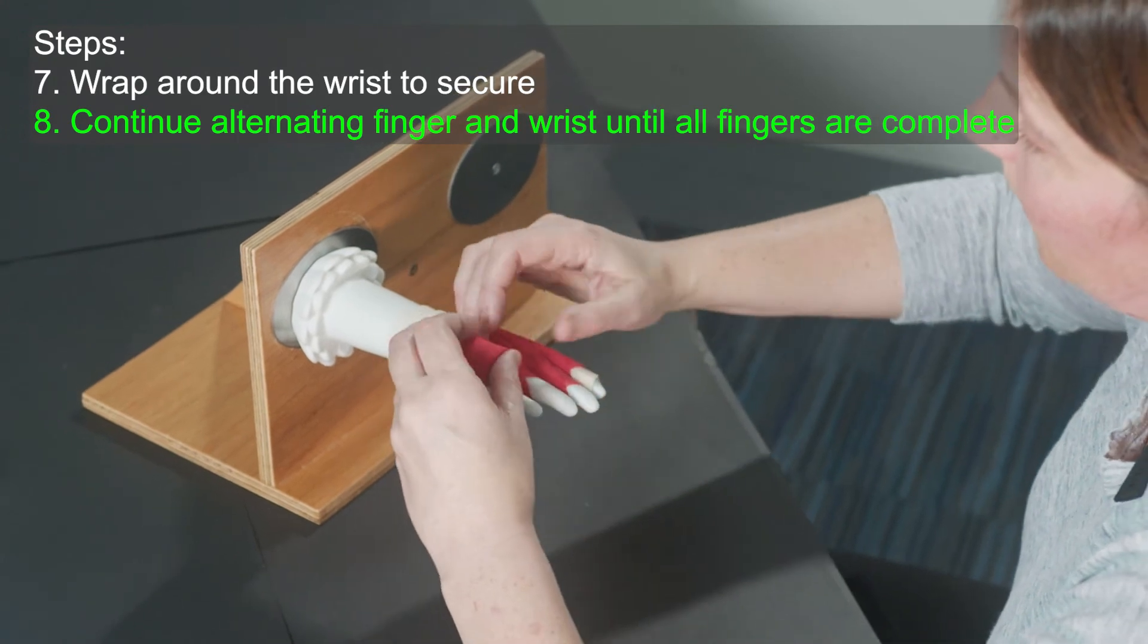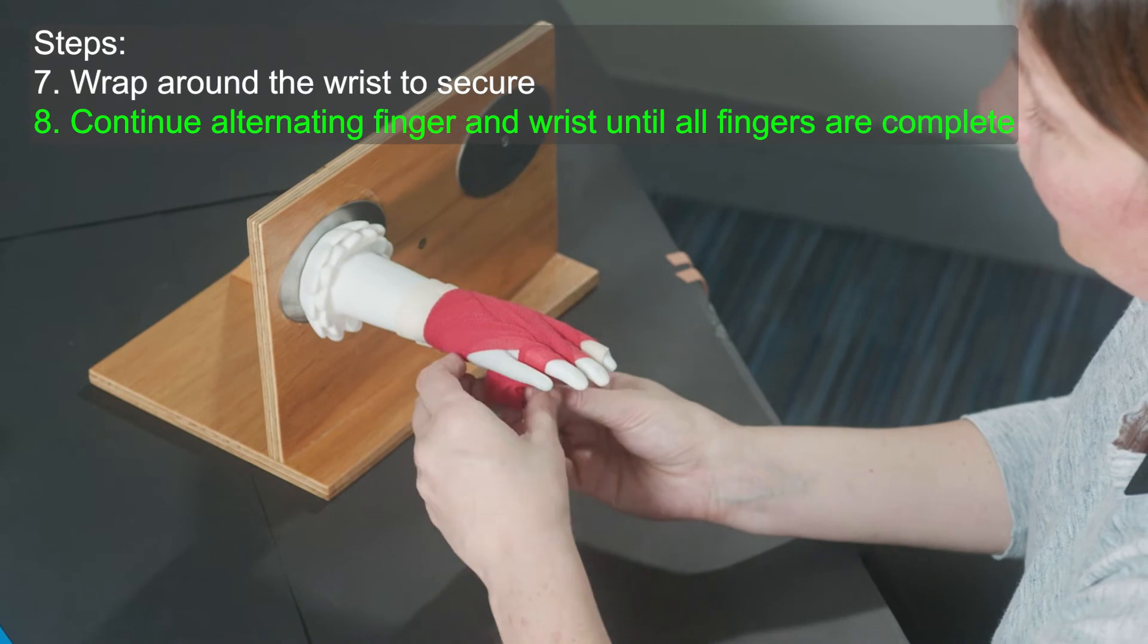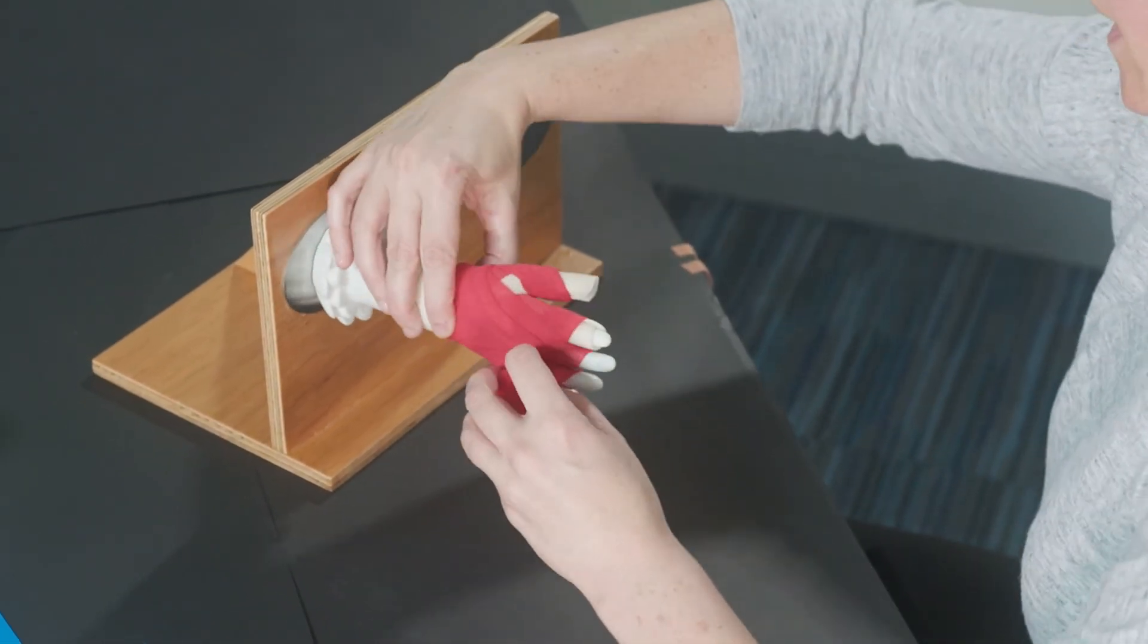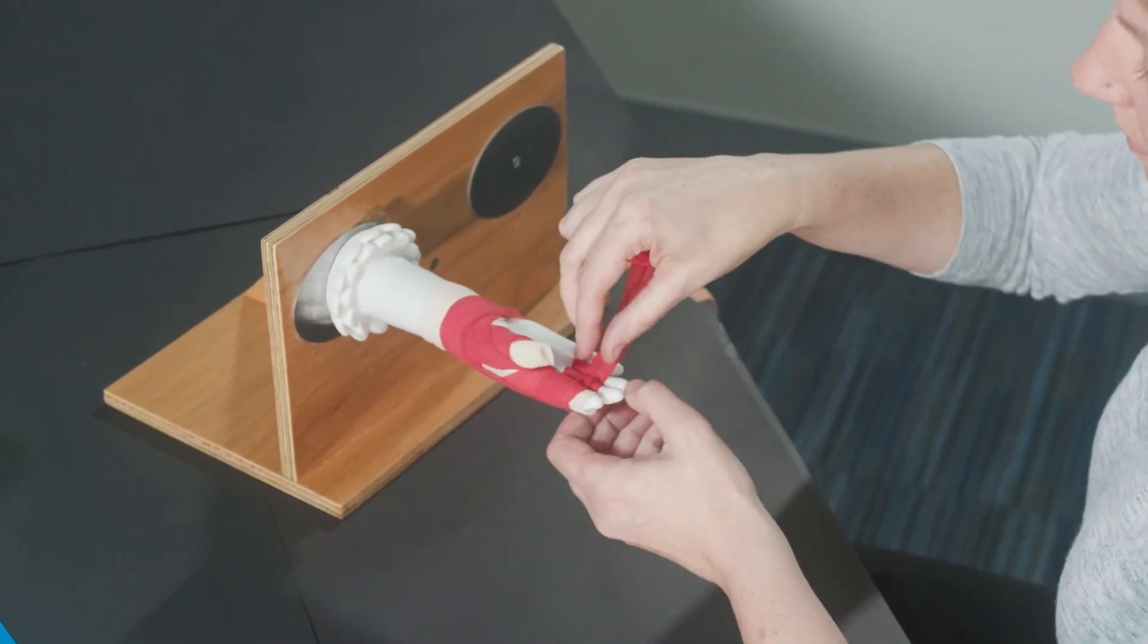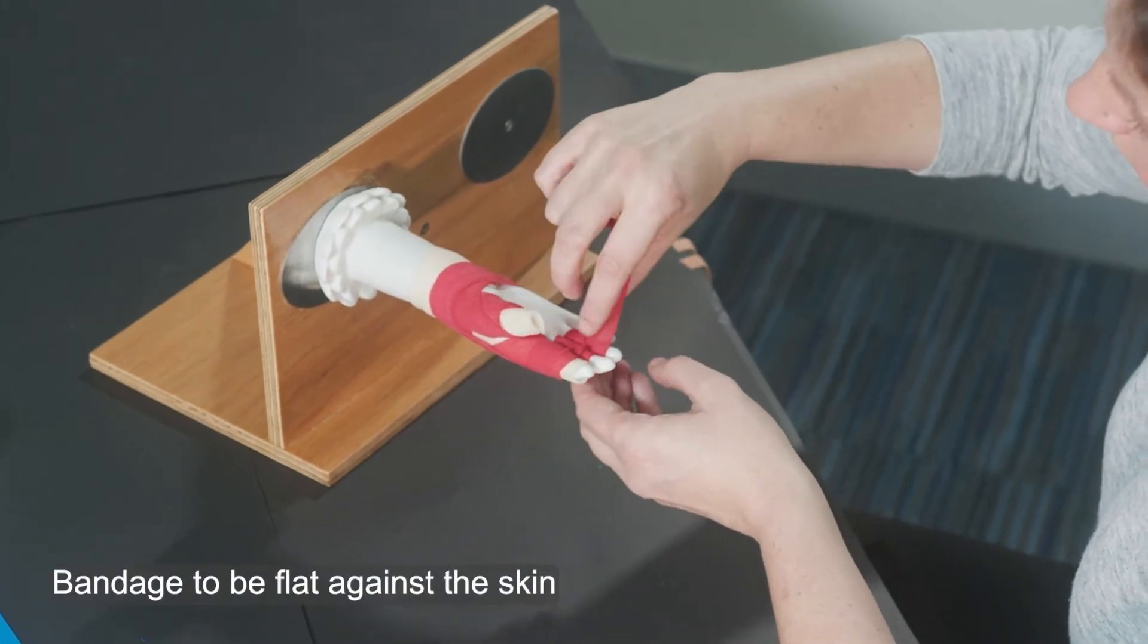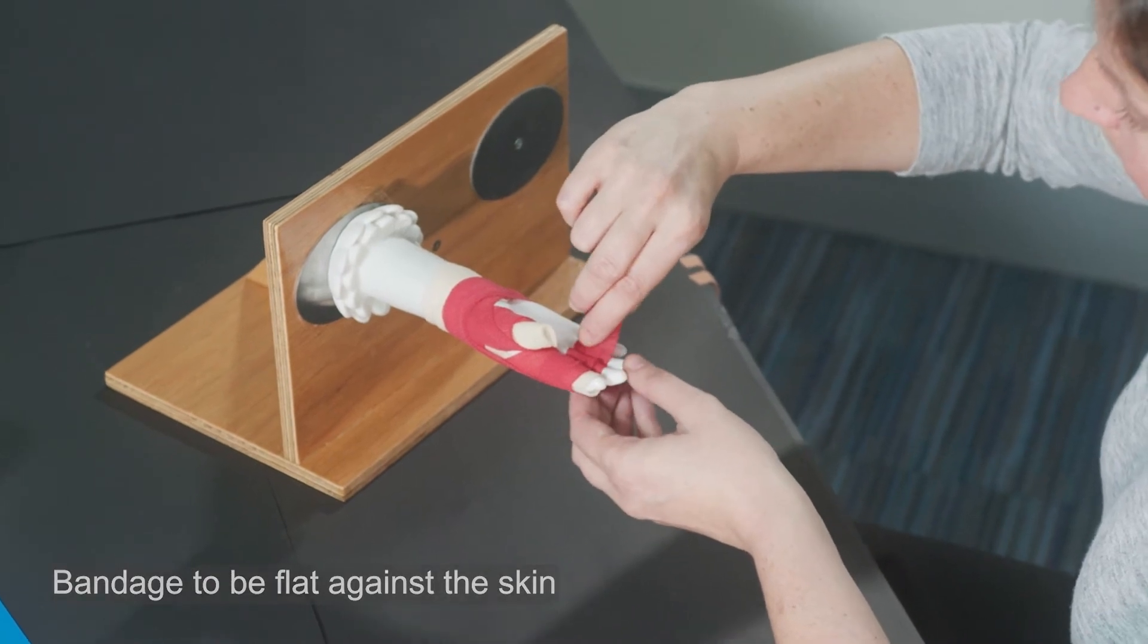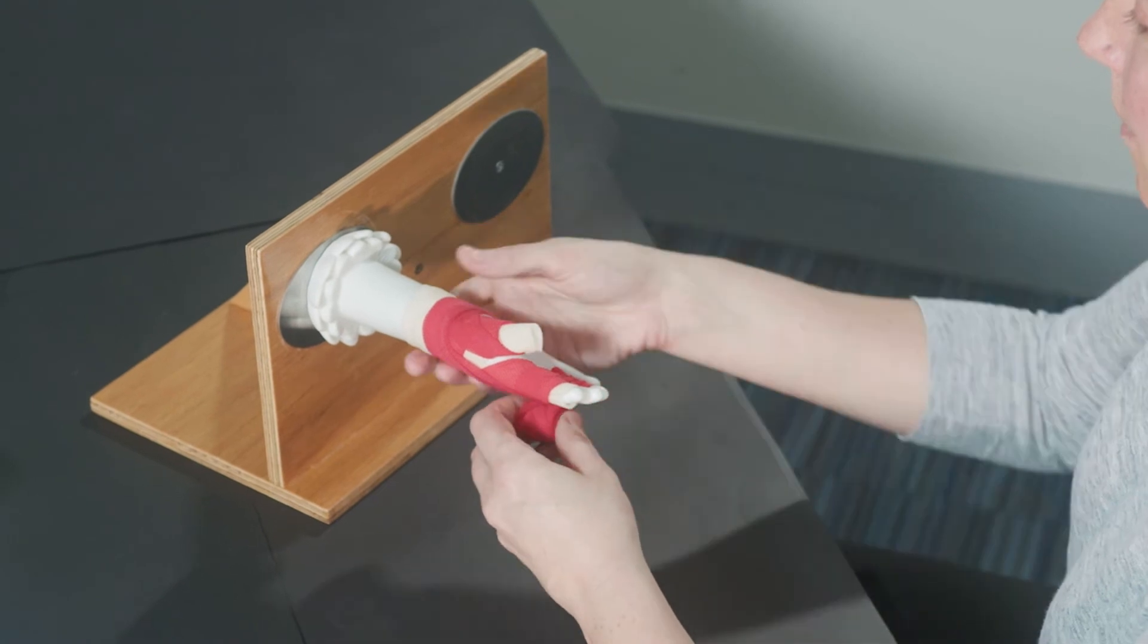Around we go again, holding your dressings, making sure that your wrap is nice and soft and not putting too much tension on it. Through the web space around each finger. Just checking every now and again, I could see that I had a bit of a kink in my wrap there, so I want to just come back and make sure that that's as flat as possible.